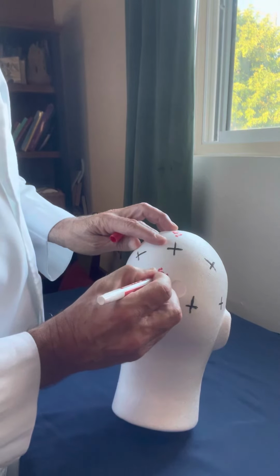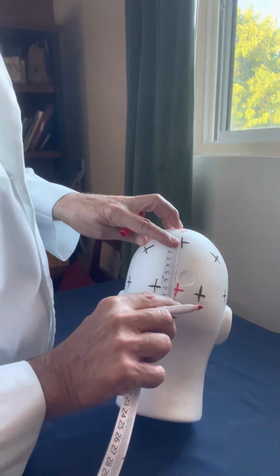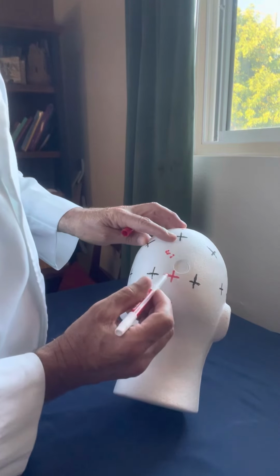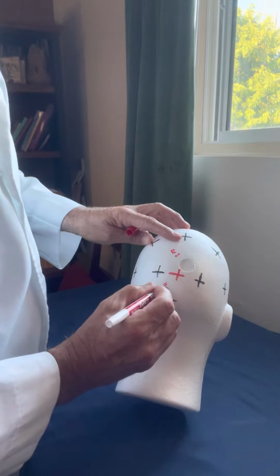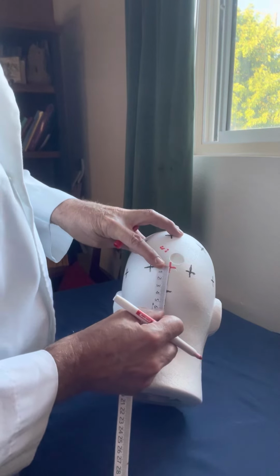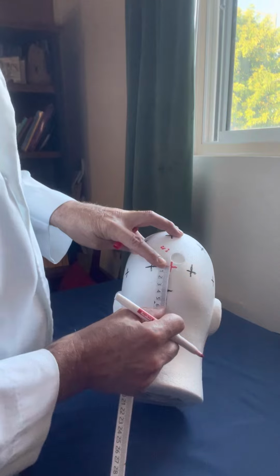Let's see what our measurement was there. 6.9. And lastly, from OZ to the inion should be 10% of the nasion to inion distance. So that should be 3.5 centimeters, and it's about 3.5 centimeters.